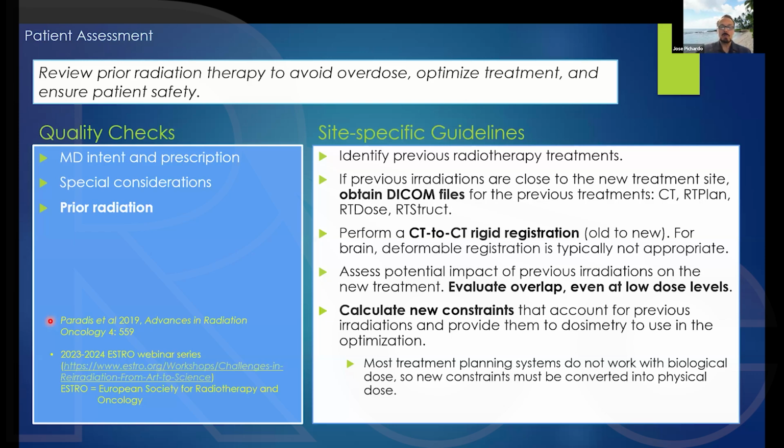The problem with deformation is that it has to be done very, very carefully. Always make sure that you're mapping the correct voxel in the anatomy in both images, because you could have a major discrepancy between where you're placing those.